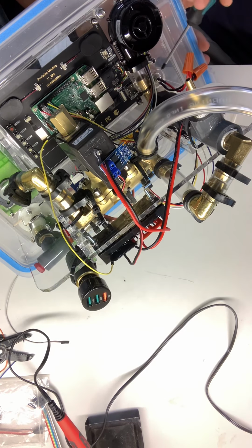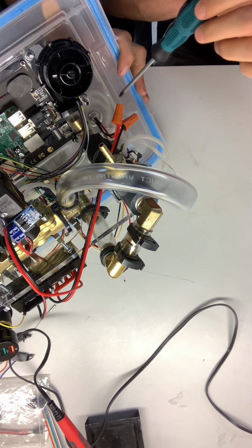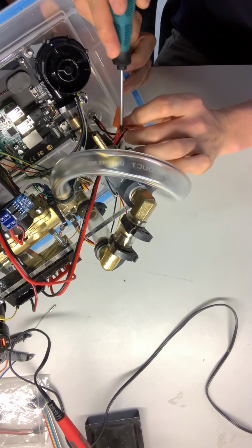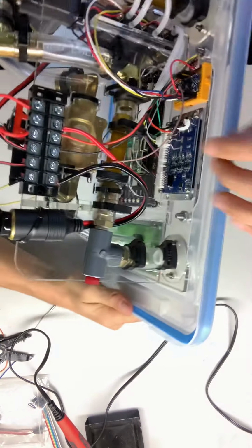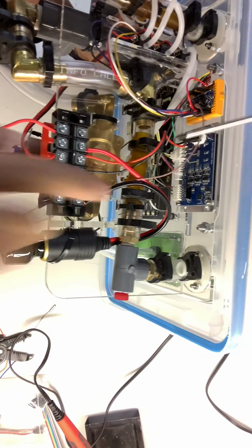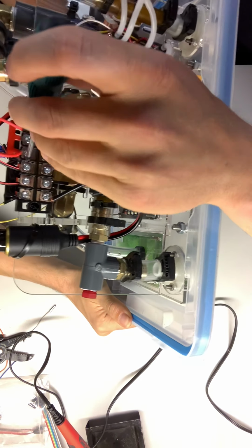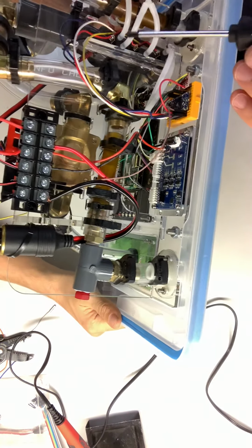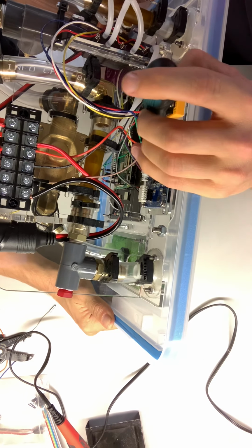So let's go from our 12-volt supply. Now we all have COVID. Red, this is the 12-volt input. Yep, 12-volt input. Red goes to the bus bar. From there, we power our 12-volt to 5-volt converter, which is red, black. From that same power supply, so that was the input, we have the solenoid, these 2 wires, red-black. Should we do solenoid now, or after the bus bar? And then the power supply to the motor driver.